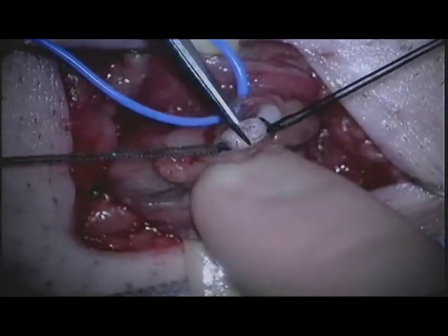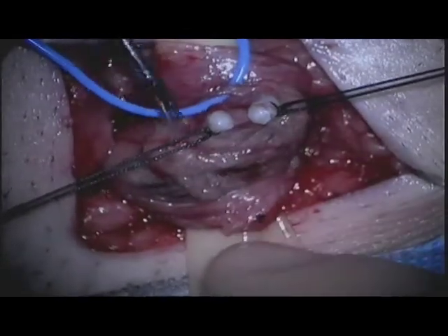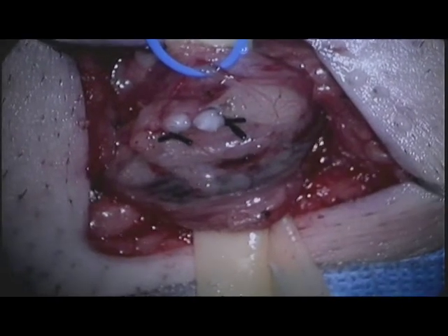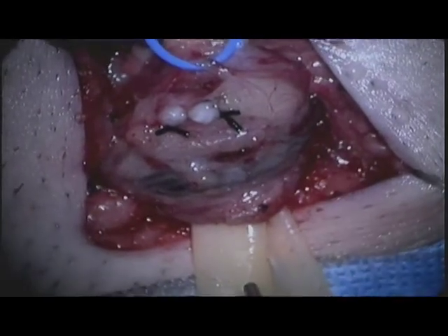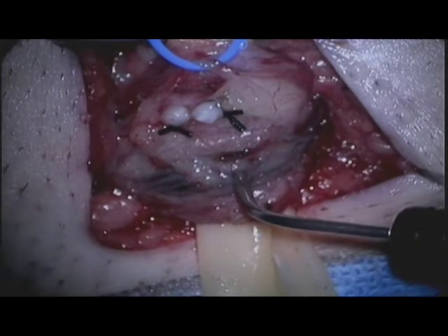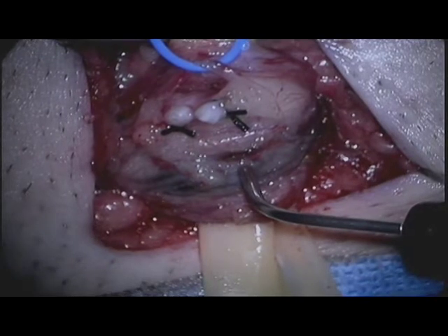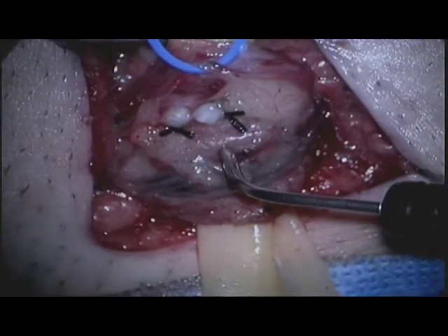The vasal artery and vein will be preserved until the main testicular artery has been identified. When the testicular artery cannot be easily visualized, a microdoppler may be used to identify the general region of the testicular artery. Here, normal saline is used to increase conduction and allow for better identification of the artery. The testicular artery has been confirmed and is located along the bottom portion of the screen. The vasal packet is also evaluated, and there is noted to be good pulsatile waveforms.